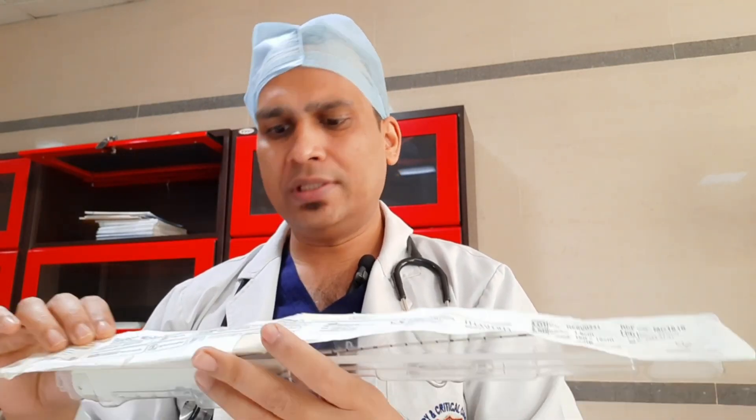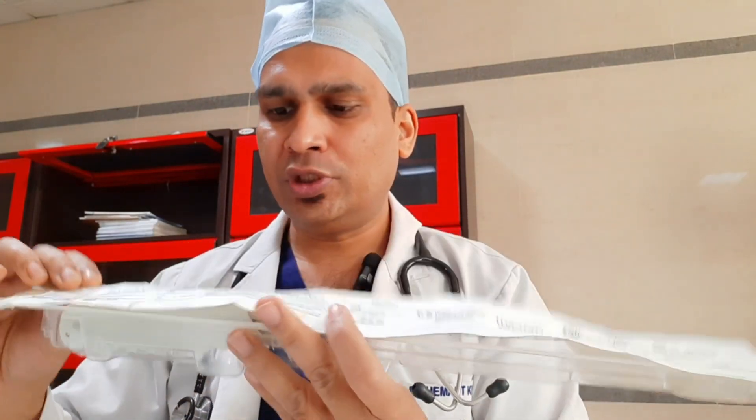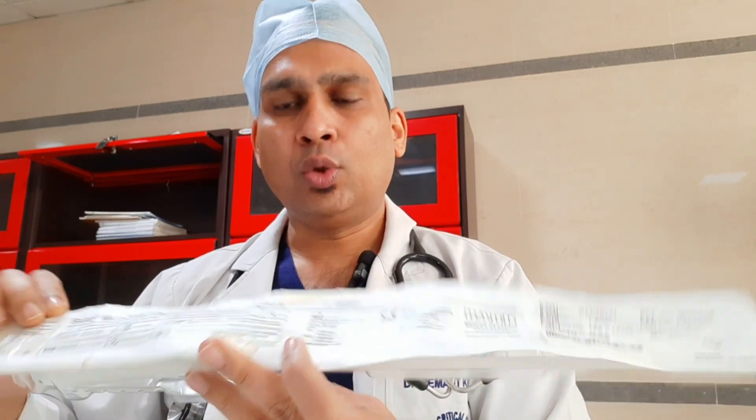Good morning friends. Today we will see a live procedure of ultrasound-guided lung biopsy. For biopsy we need a needle, so what we are using is a biopsy gun. This is a disposable core biopsy instrument. Here you can see this is a 16-gauge needle and the length is 16 centimeters.